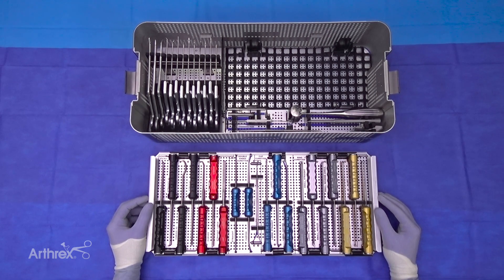In summary, this is a very exhaustive and robust set that has everything a surgeon needs for an arthroscopy procedure. We hope it helps our surgeons treat their patients better. Thank you very much.